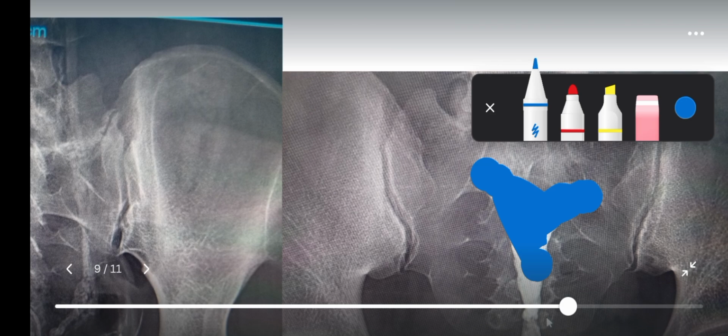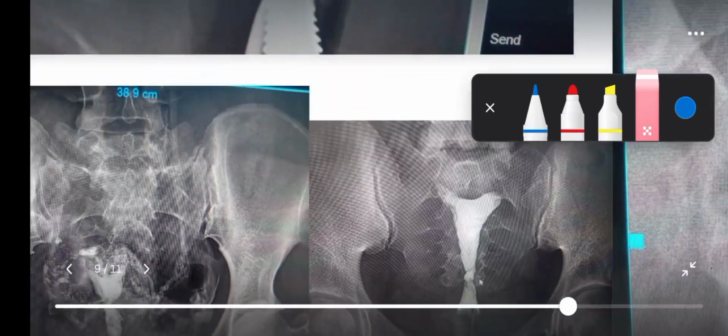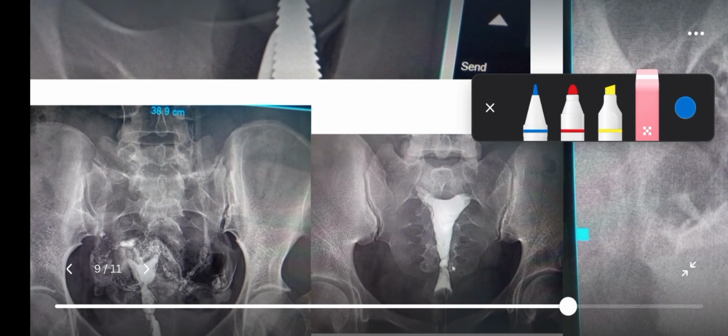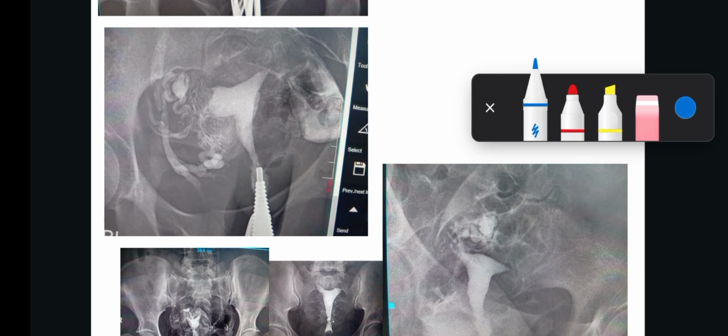And that is why we advise the patient that during HSG, even though they may experience some pain, they are to try to feel calm. Also, Buscopan is given before the introduction of this dye to also help them feel more calm during the procedure.